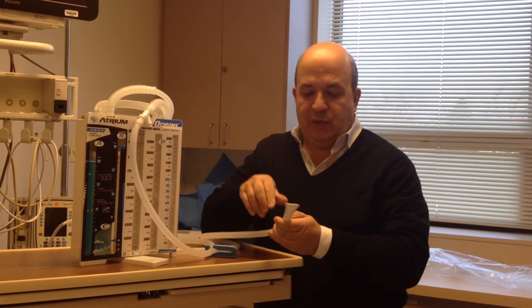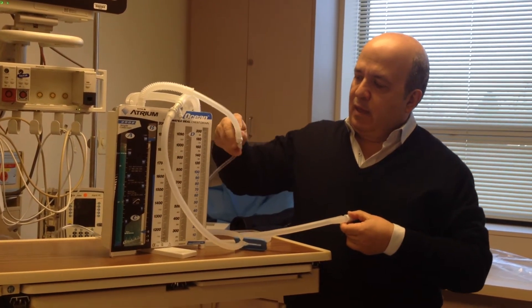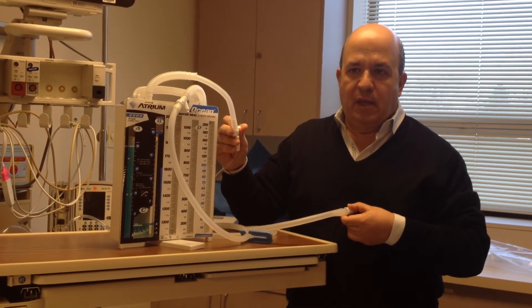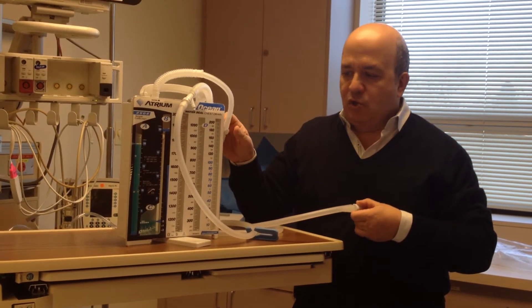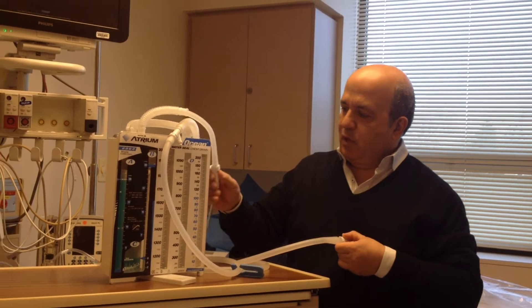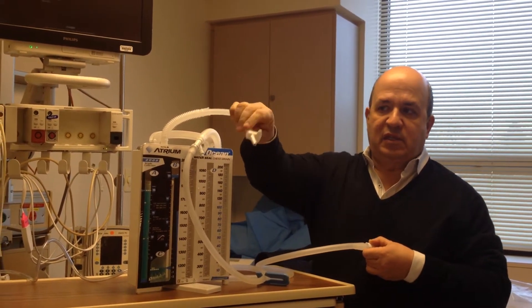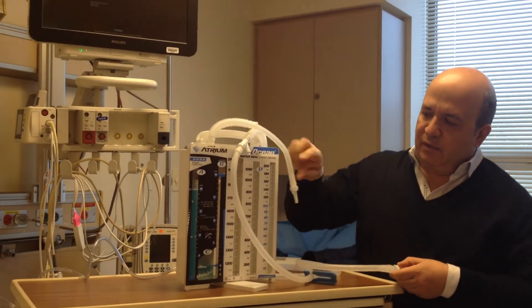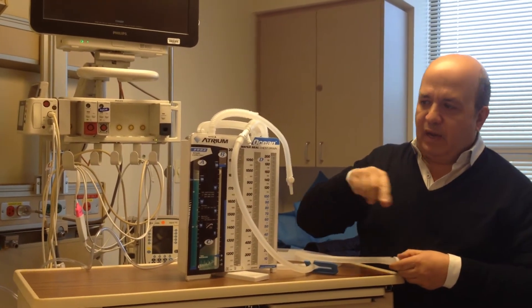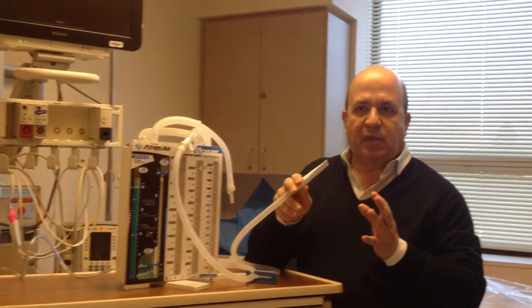So you'll see an order that says 'chest tube to water seal.' We're going to pretend this is a chest tube into the patient. This is not water seal — this is a closed system that will cause a tension. So what you do is you take this and you disconnect it from the suction. This is still not water seal because this is closed to air. What water seal means is that the chest tube connected to this box will allow air to flow back and forth.